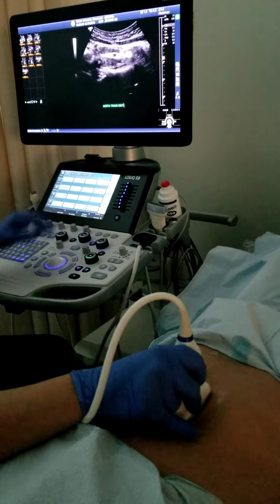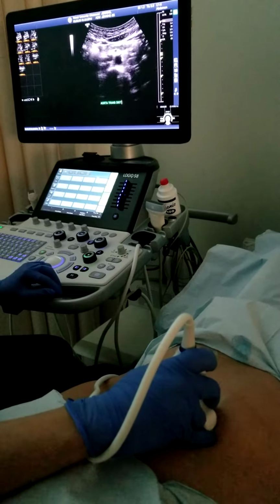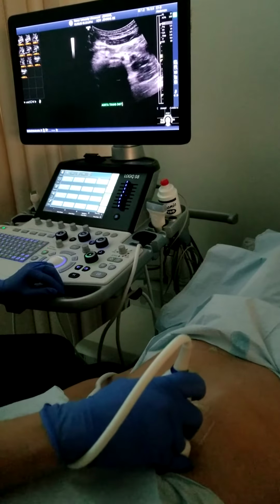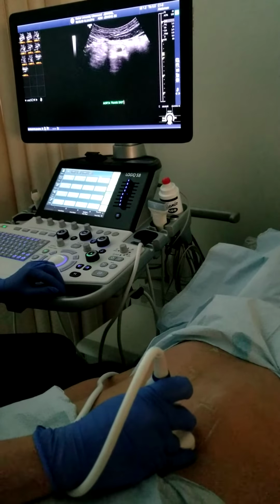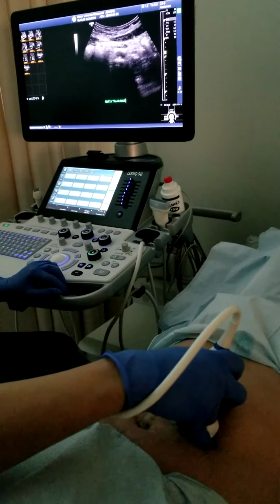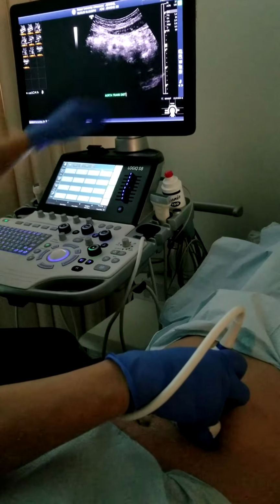Next image is going to be transverse distal. So I'm going to go transverse right here. I'm going to follow my vessel down until I see the split of the bifurcation. There's a little bit of gas there, so I'm going to try to hop over it. So I can see my bifurcation right here.